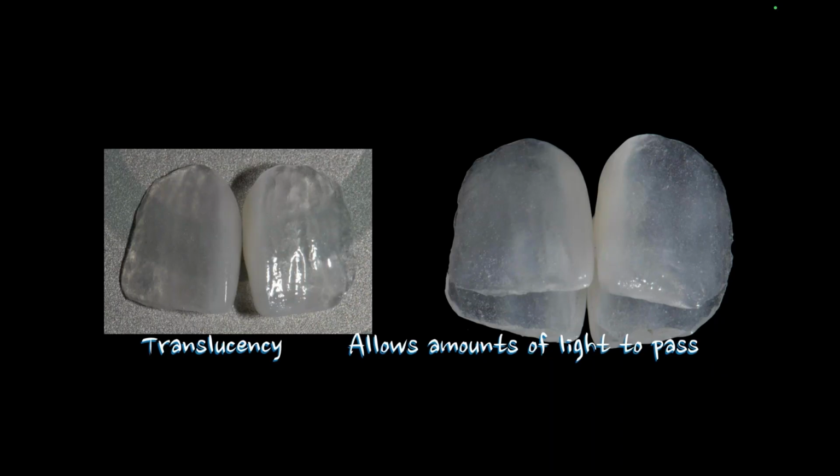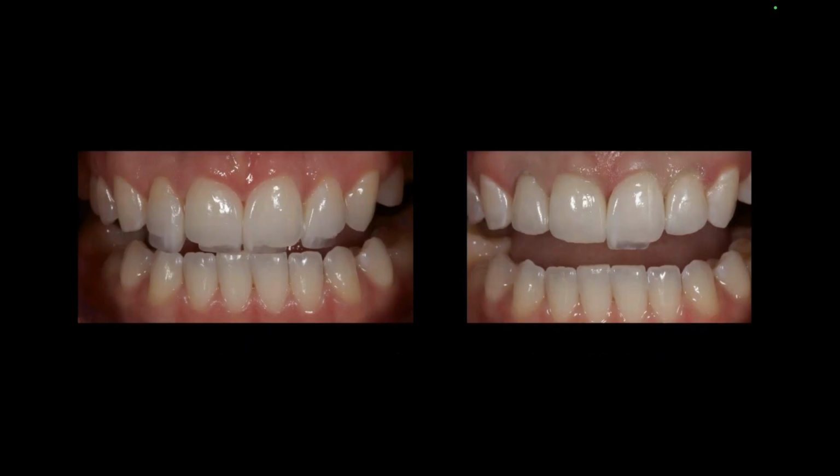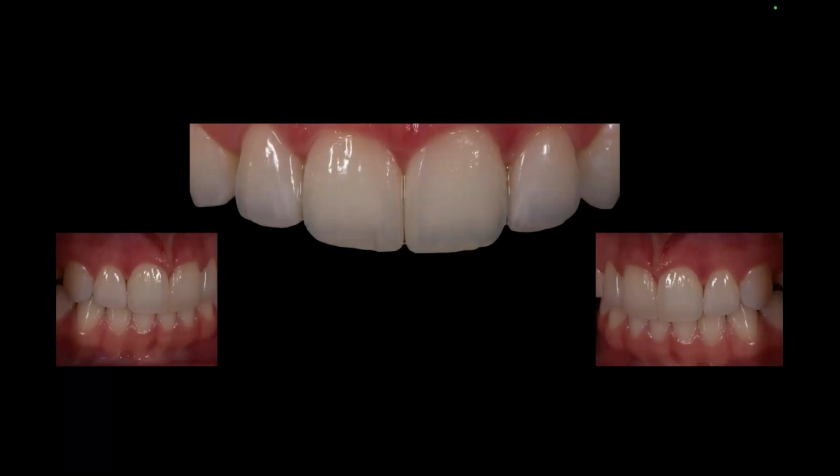But when I put this in the mouth now, look what starts to happen. You can see as I'm sliding it in, you can still see all those translucencies, but as it goes up and covers the tooth, you don't see that junction between that line and that line anymore, which is the beauty of utilizing the teeth behind us. And here's our final result of just window veneers, additive.